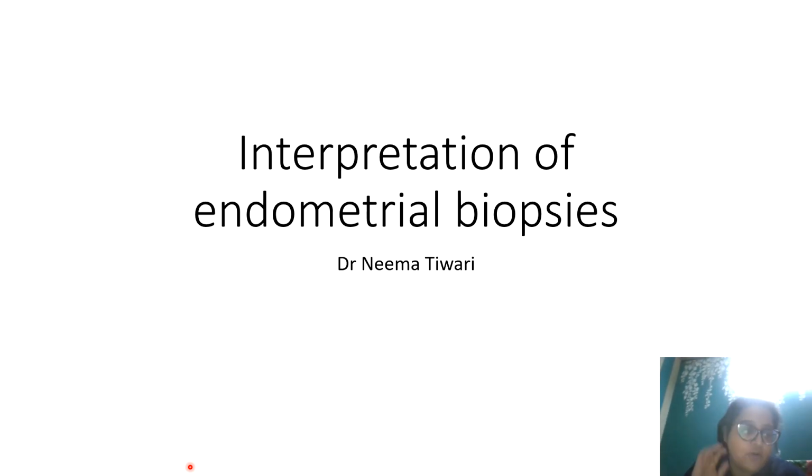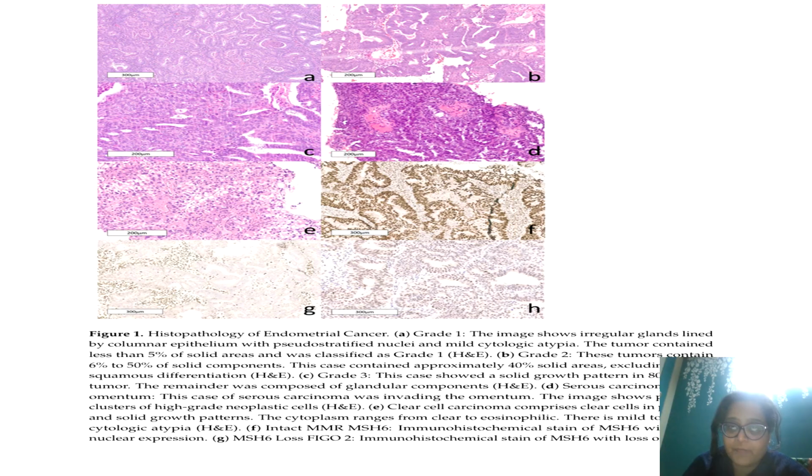So after a long time, just before the new year starts, I'm gonna be taking up a very short topic on interpretation of endometrial biopsies. And we've done a lot of hemat this year. I'll also be doing a bit of histopathology in between my mostly hemat lectures, and I hope it is beneficial and helpful to you. My face might not be very visible, but at least the slides are. So very quickly, endometrial biopsies.